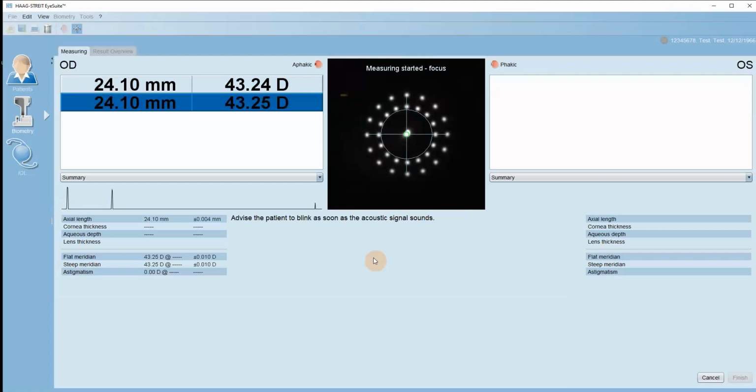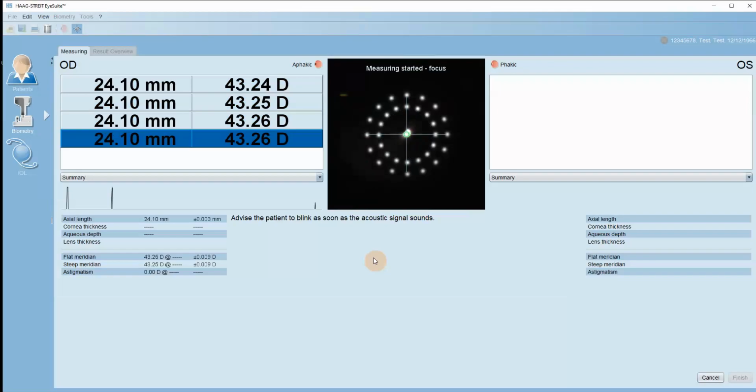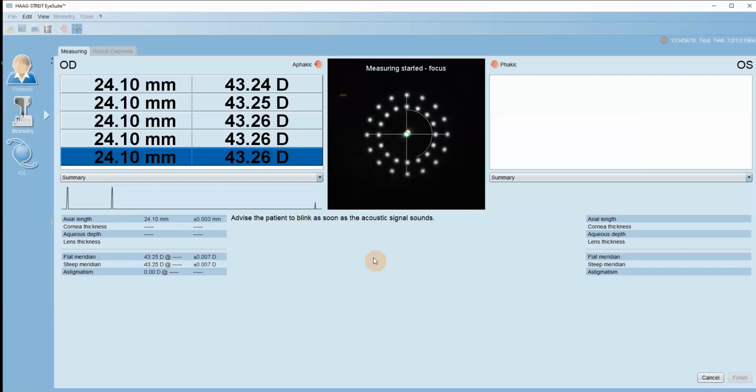If the button is pressed within 10 seconds after a measurement is finished, the procedure for the repetitive measurement begins with a zoomed view, and only one more click is required to start data acquisition. If neither the Lenstar nor the patient has moved between measurements, this will improve the measurement speed.